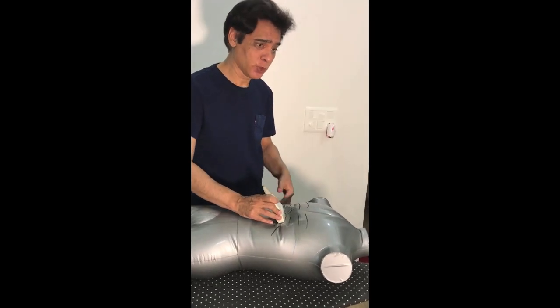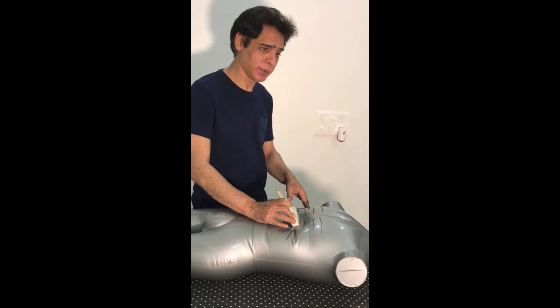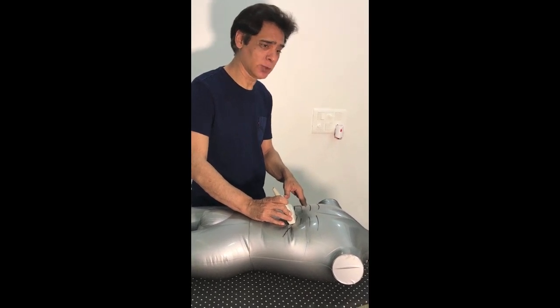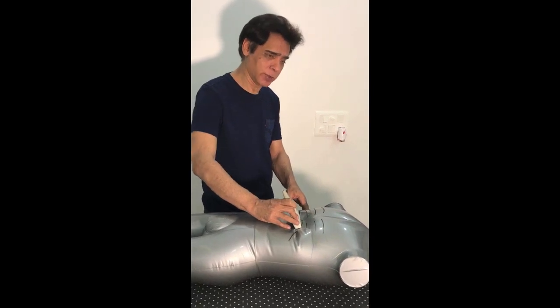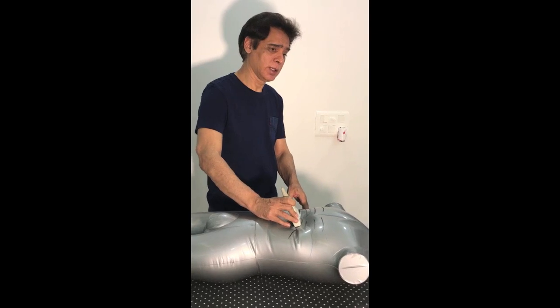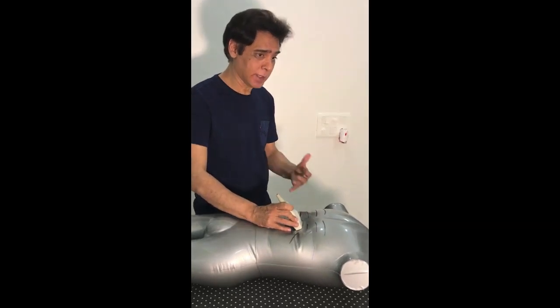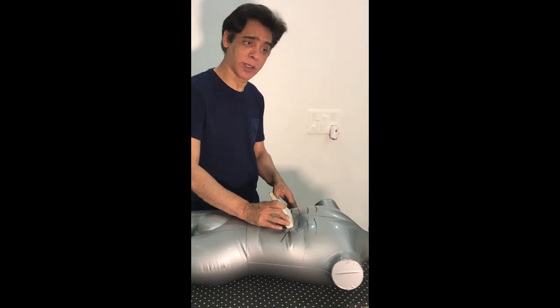Now, so many times you'll find that this dot-like area is not very clear. It is so small that you may not be able to make it out. Many times you just rotate the probe a little bit here and there and you can still make it out, but especially when it is dilated, bigger, it is much easier to make out.